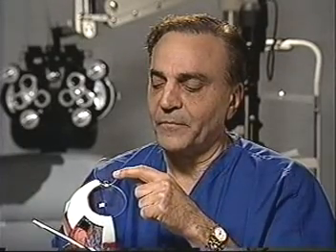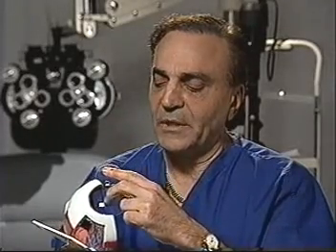Welcome to the New Jersey Eye Center, and soon we will be performing live LASIK surgery. First, let me try to explain in simple terms, what is LASIK? LASIK is a surgical procedure whereby we use a laser beam to change the shape of the cornea so as to eliminate the need for glasses or contact lenses. It takes place in two steps. The first step, we use an instrument to pull up a layer of the cornea, like that, raised layer of the cornea. Then we use a laser here to reshape the cornea. We replace the flap, it assumes the new shape of the cornea, and we've eliminated the need for glasses.